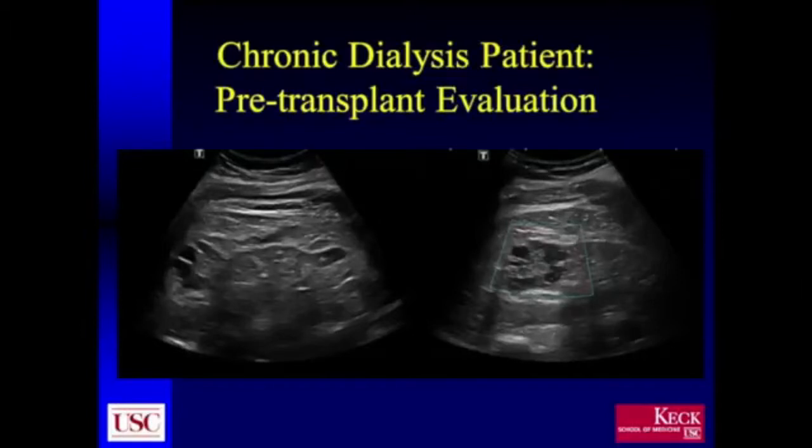One of the other common examinations that we do in patients with renal failure is the pre-transplant workup. All the patients in our institution who are going to undergo a kidney transplant evaluation will go on to have abdominal ultrasounds. A lot of these patients will have been on dialysis for a long period of time, and there is an increased incidence of renal cell carcinoma in these patients.